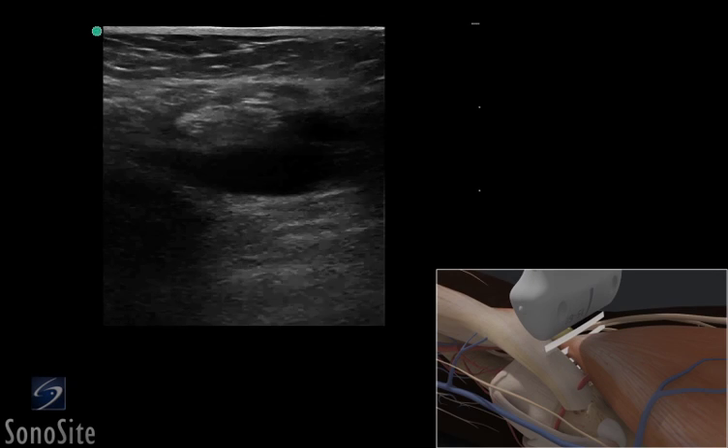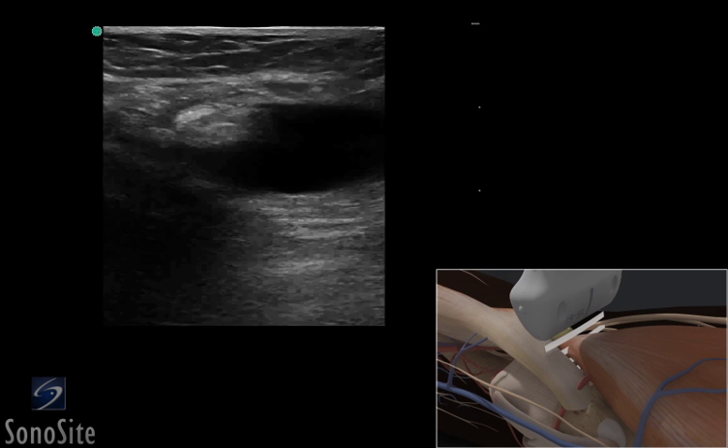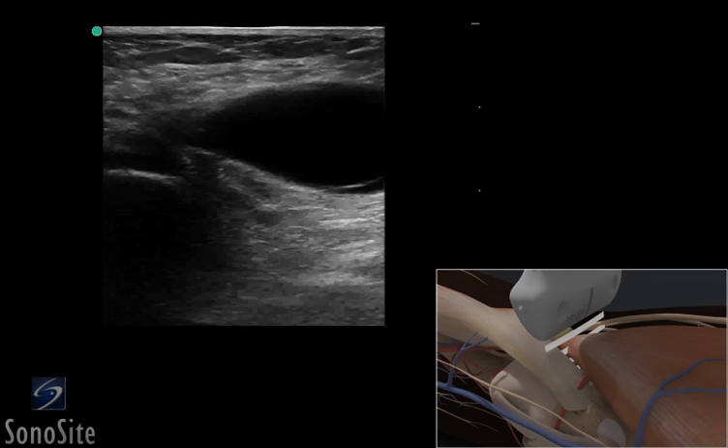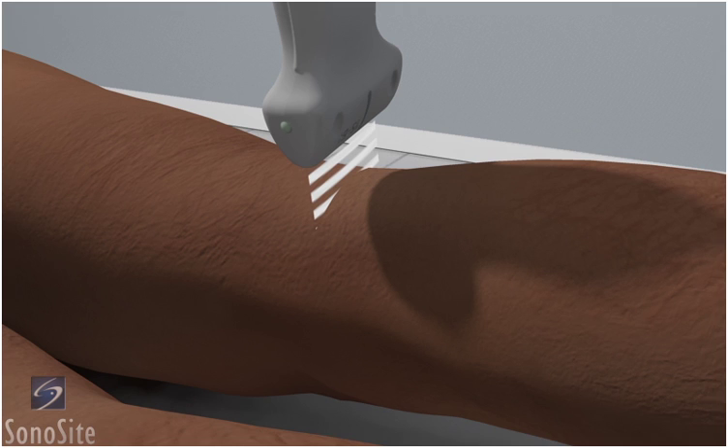A linear array transducer with a musculoskeletal exam type is used to perform an ultrasound-guided aspiration of a Baker's cyst. The patient is in a supine position.